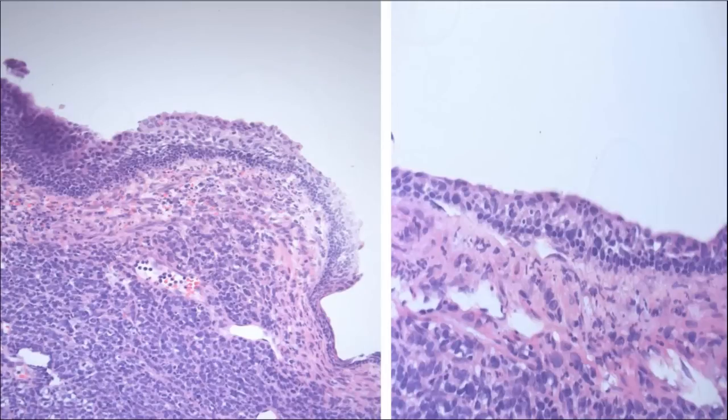So like I said, you can have a whole variety of different things. So you look in different areas of this neoplasm. We actually began to see that there was a little bit of squamous epithelium above it, and it looked funny, somewhat possibly dysplastic, not really carcinoma in situ, but you could see there were cells within the epithelium that looked atypical. It certainly was not something that we would say was carcinoma in situ, but that began to help us with our differential just a little bit more as we went into this tumor.